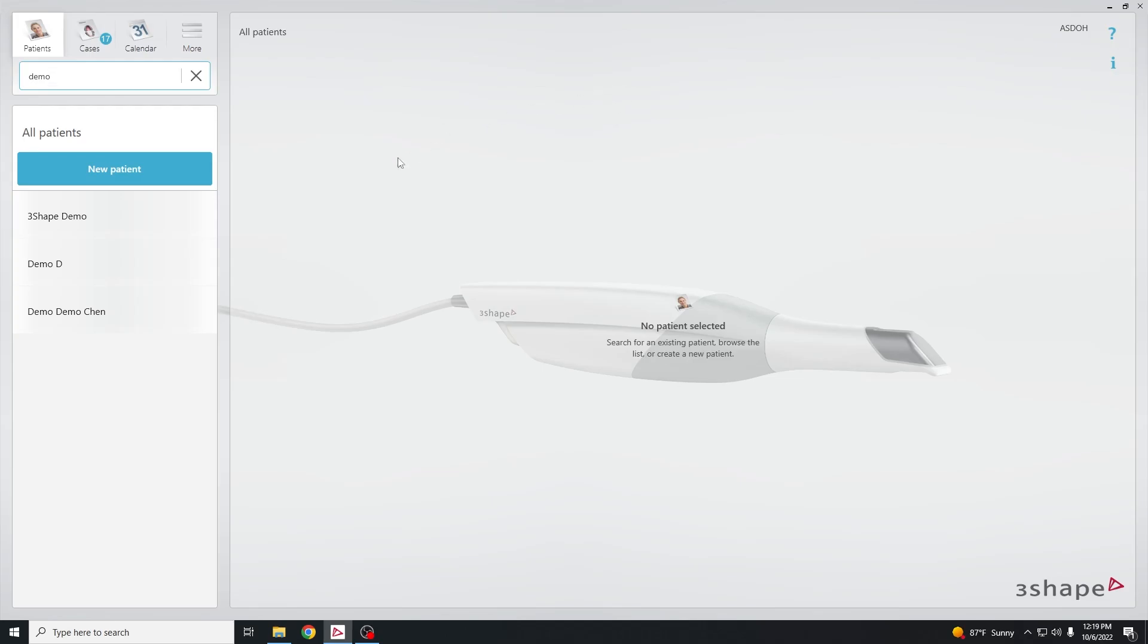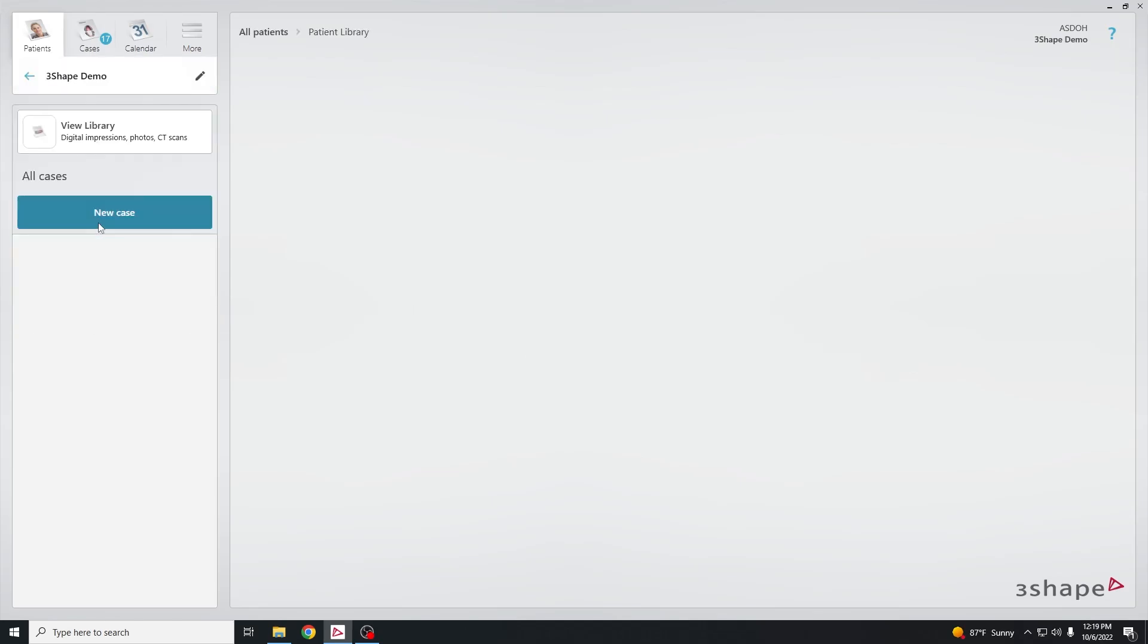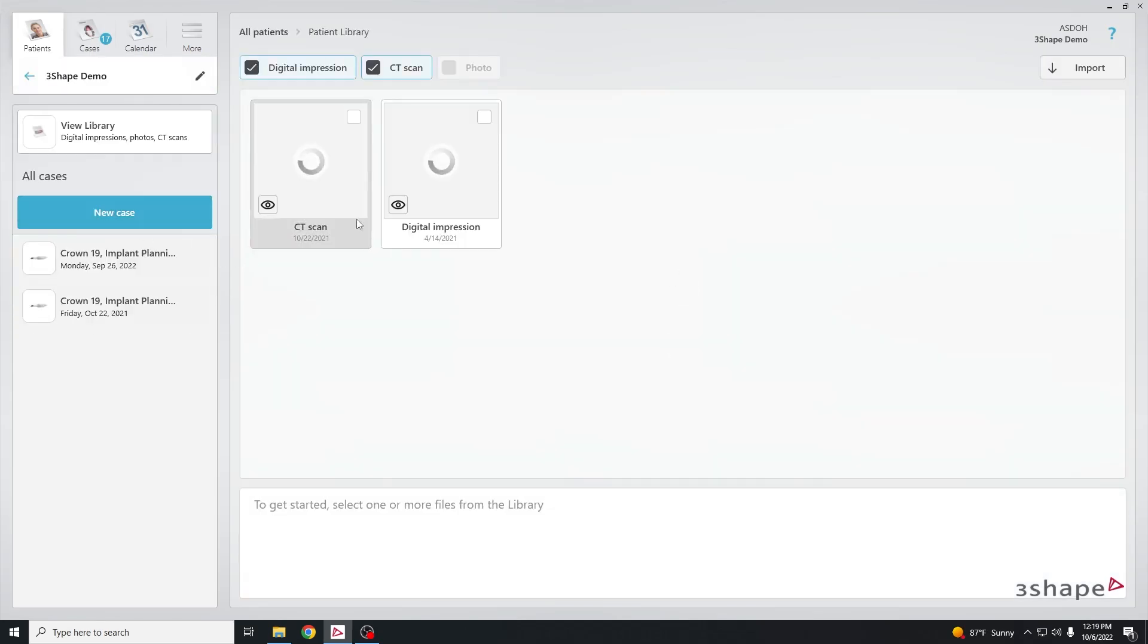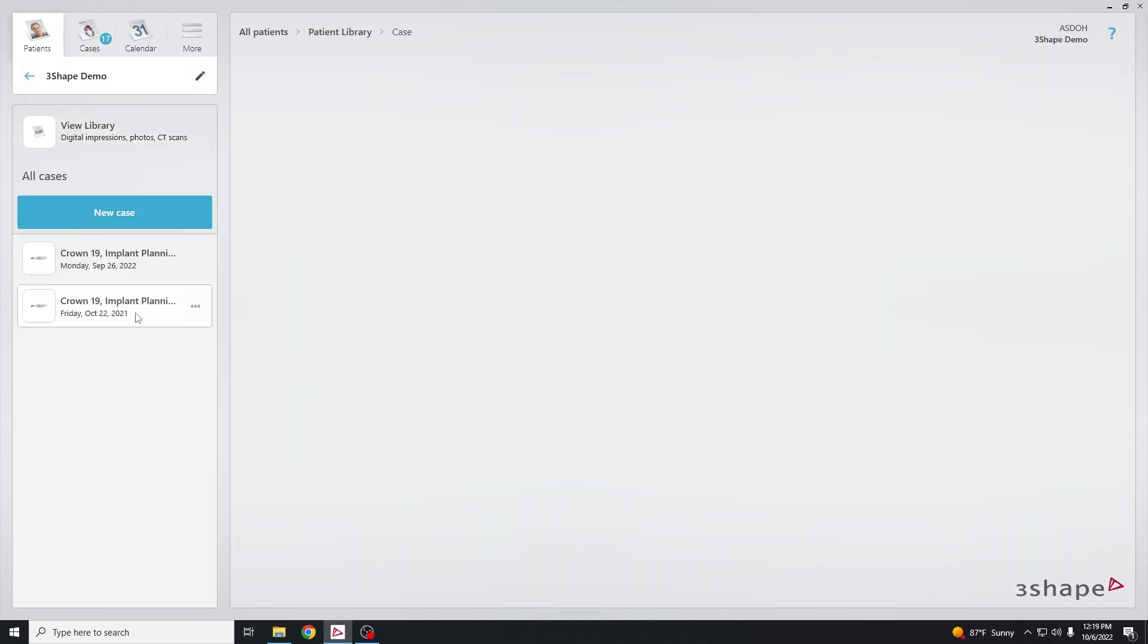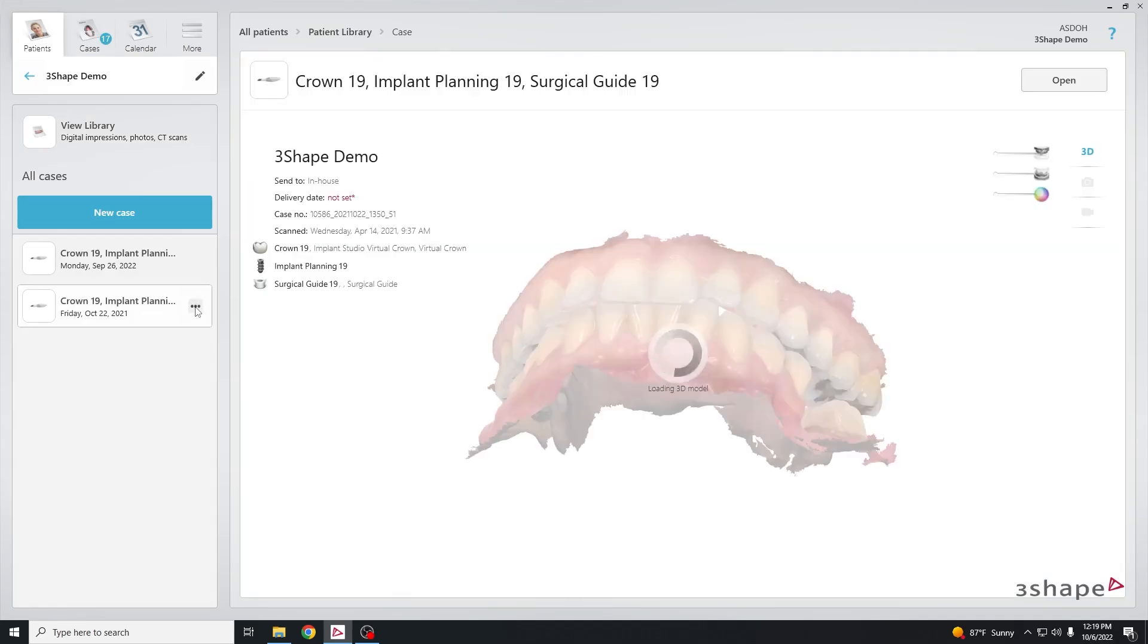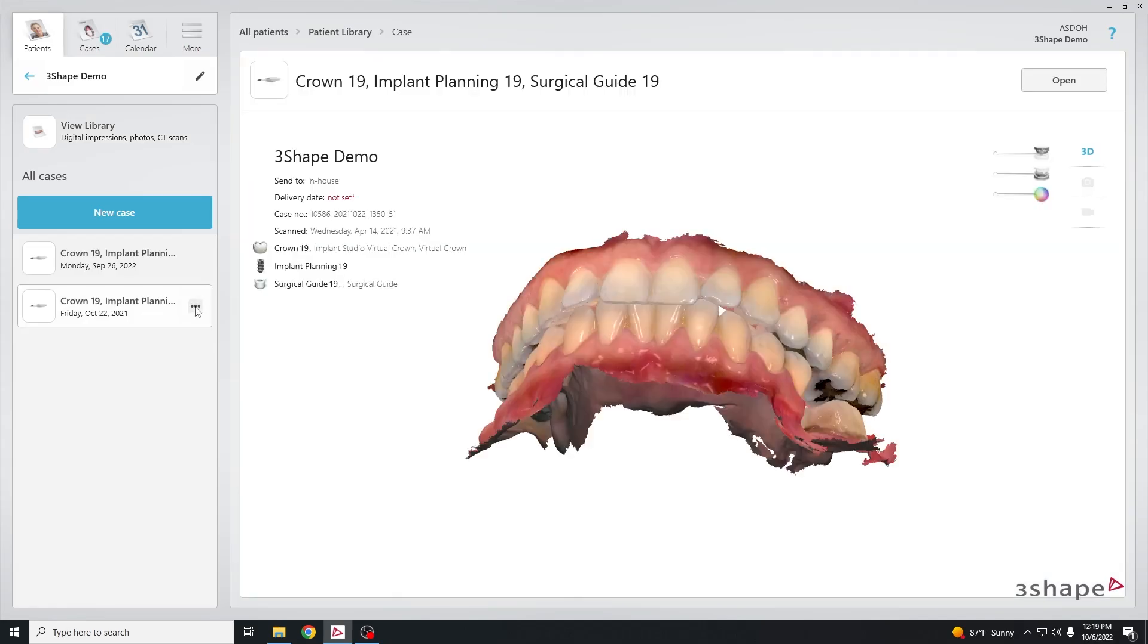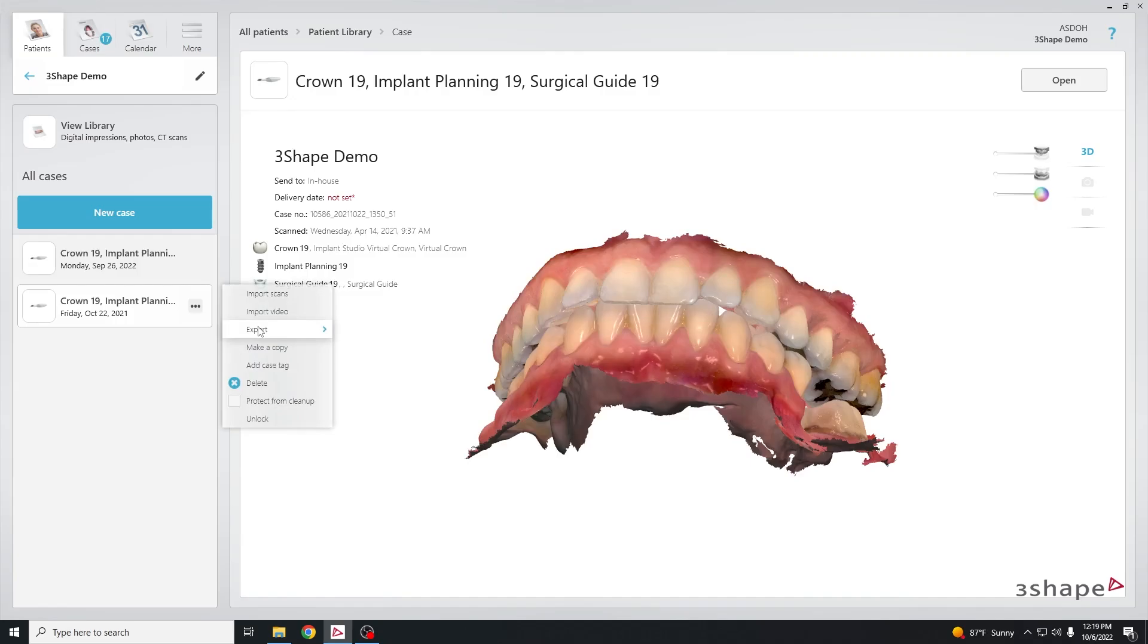Launch the 3Shape Unite software and type in your patient's name and then select the patient. Click on the case and where the three dots are on the left side, click there to export and select scans.